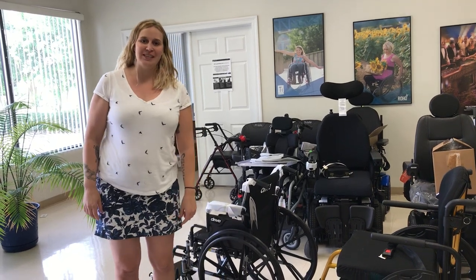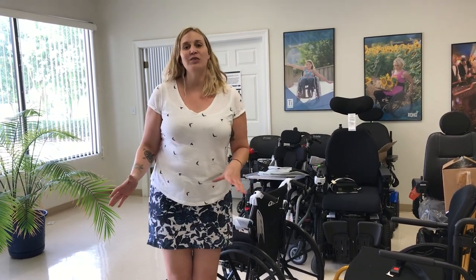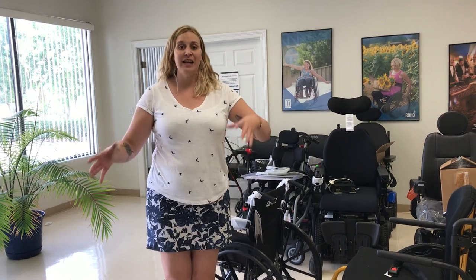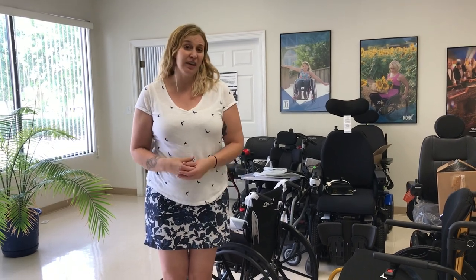Hi, this is Joy, your assistive technology professional, and today we're going to talk a little bit about manual wheelchairs. By the end of this, you should be able to tell the difference between a custom wheelchair and a standard durable medical equipment type of wheelchair. We're also going to talk about some of the benefits of a custom wheelchair.